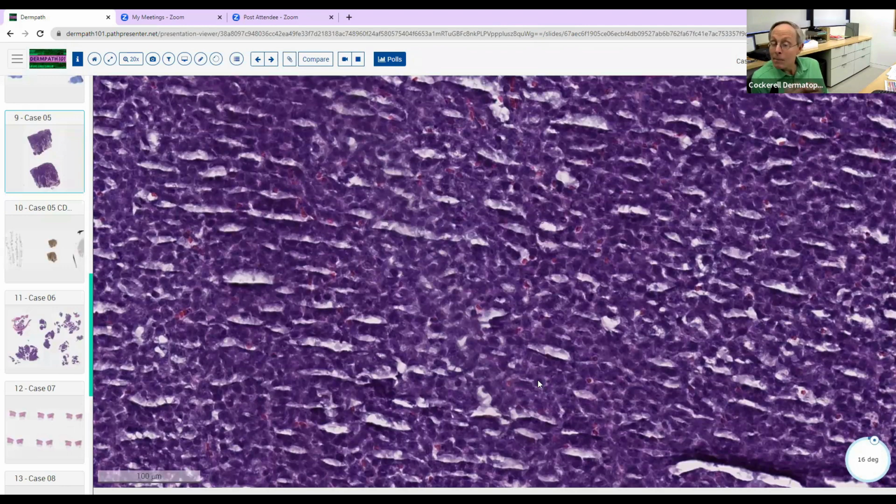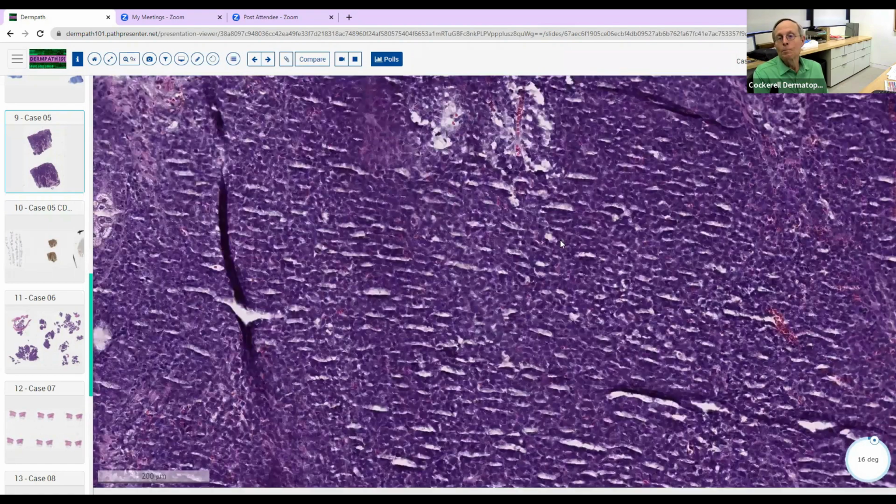You don't see that in a lymphocyte, right? Lymphocytes are just basically no cytoplasm. They're just all nucleus. So here we've got some cytoplasm around it. So it kind of looks quasi-plasma cell-like, but not a classic plasma cell. So we say plasmacytoid. So do you have any idea what the diagnosis is here?